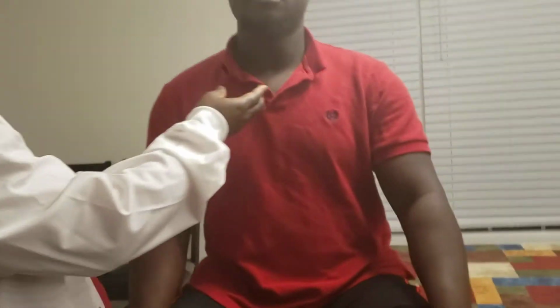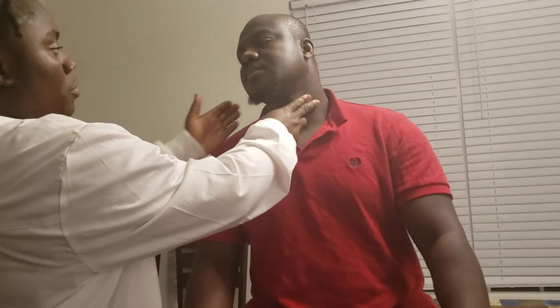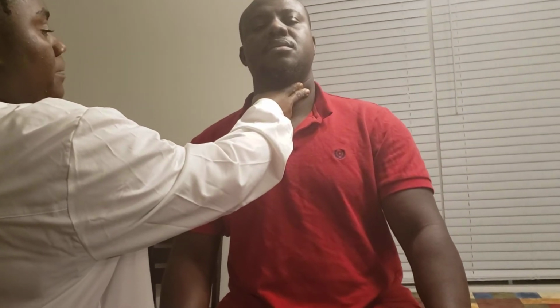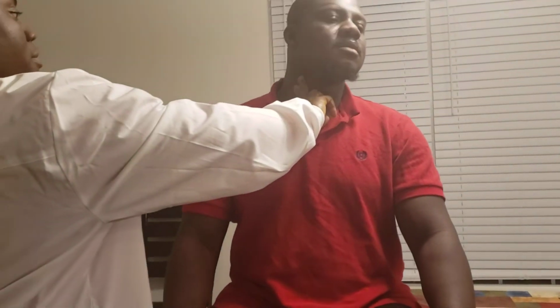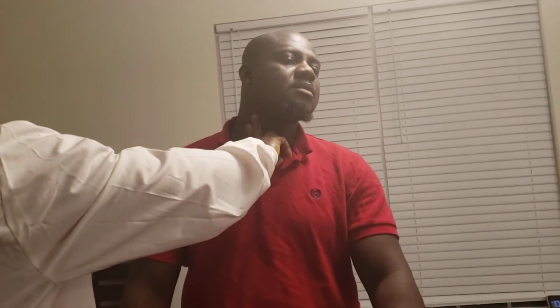All right, I'm gonna raise your head up a little bit for me. Okay, not all the way up like that. I'm going to check your carotid artery for your pulse over there. No, you don't move it, it's like that. Very good. Now check this right side here. The pulses over here on your carotid artery is a 2+ strength. Bilaterally, both the left and the right has the 2+ strength, which is very good.